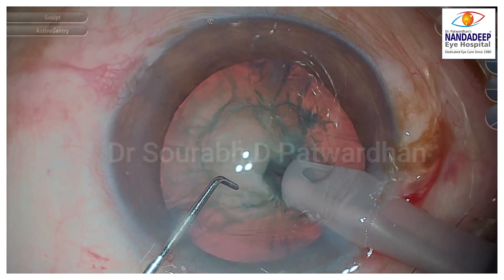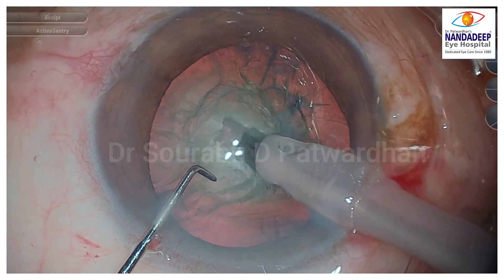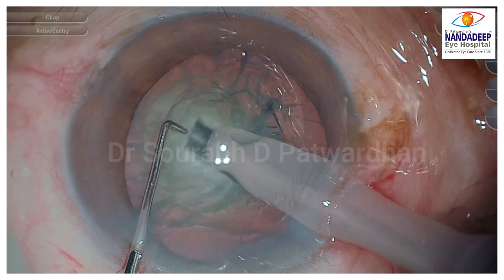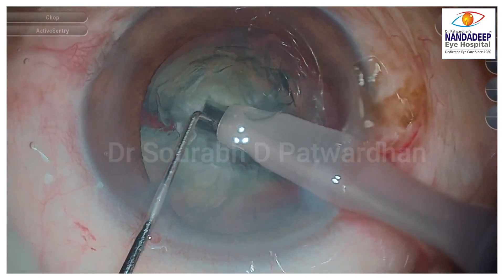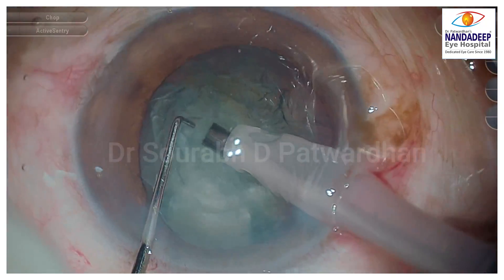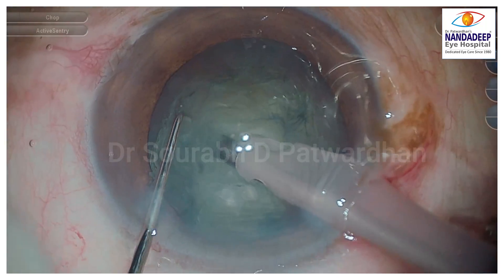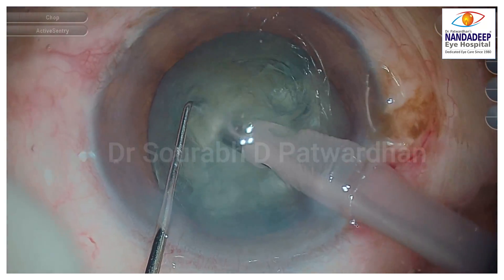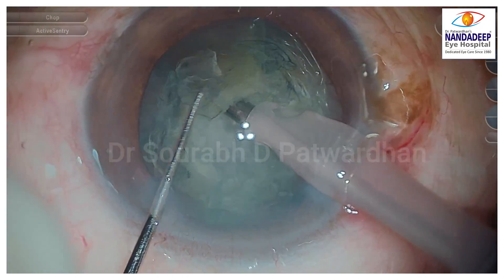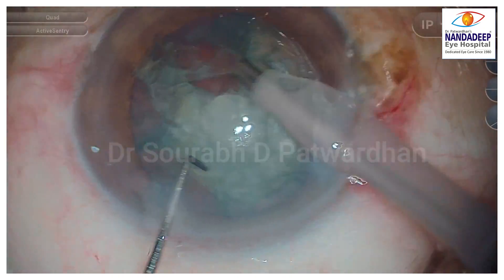This is a grade 2 cataract — the best cataract to practice your techniques. In this case I am doing the half trench chop technique, where I make the half trench and then bury it in. Always use only longitudinal FACO for chopping; the torsional doesn't work as well. I use some longitudinal bursts, bury it in, then use a 1mm Sinskey to push inside the nucleus and split them. The first piece is out, and now I am doing quadrant removal.